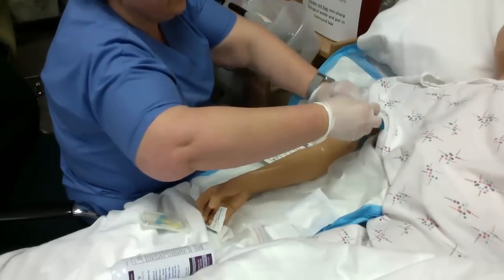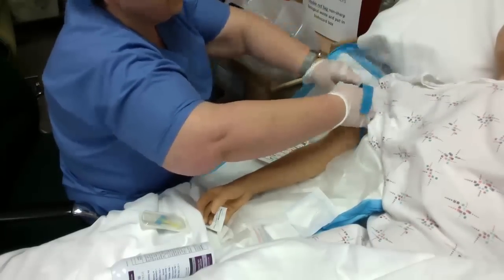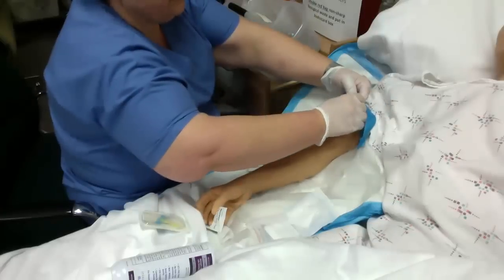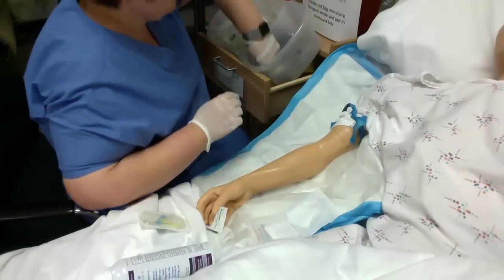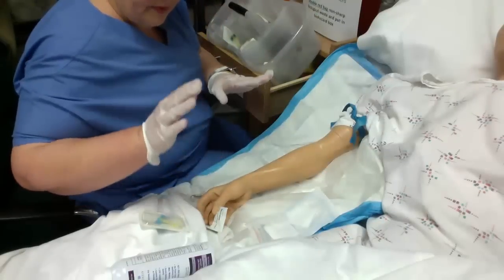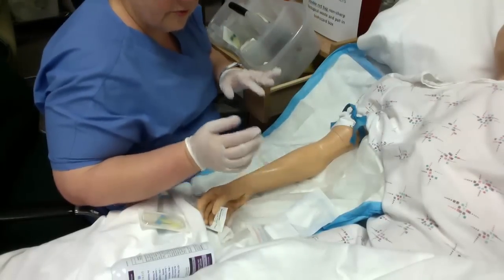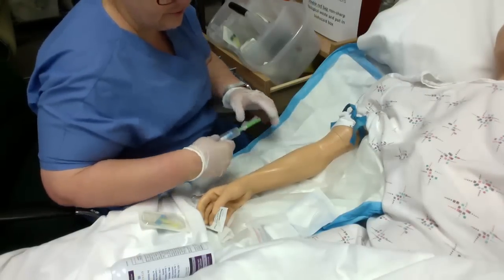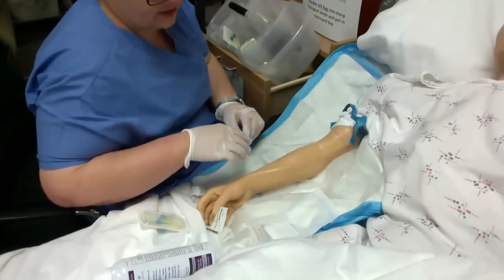Be careful when putting your tourniquet on that you don't contaminate the site you just cleaned — if so, just clean it again. In older people, I like to put the tourniquet on top of their gown so it's not pinching the skin or pulling hairs. Whatever you drop on the floor will be there when you're done. Remember, we don't isolate our shoes when going in and out of contact isolation rooms, so we do tend to track C-diff and those kinds of things.